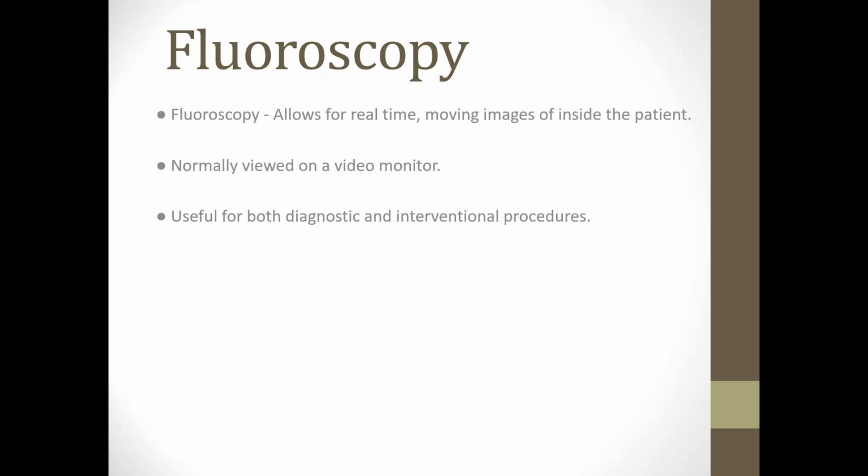So they got a better way to do it and better shielding than just a wooden case to stand on. The fluoroscopy allowed them to see moving images inside the body. And some of the pioneering radiologists and what later became cardiologists said, well, hey, maybe we can actually use this to do procedures inside patients without having to open them up in surgery.